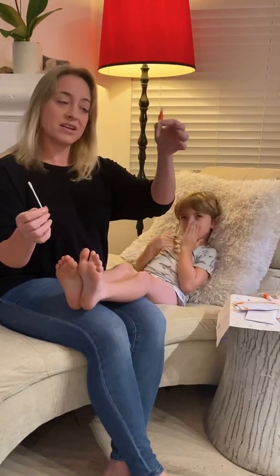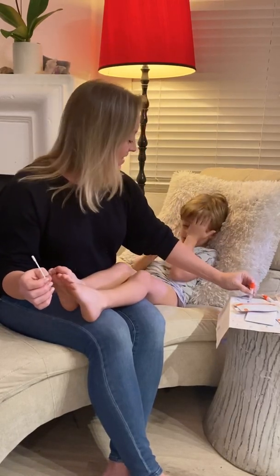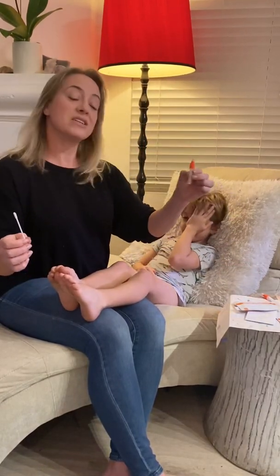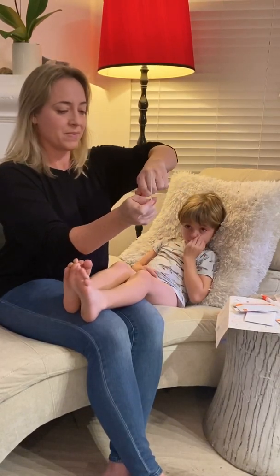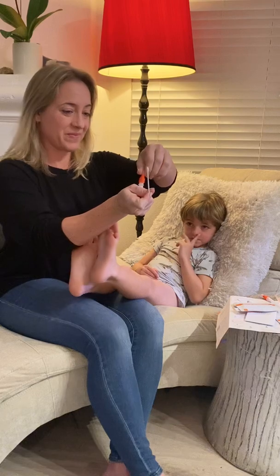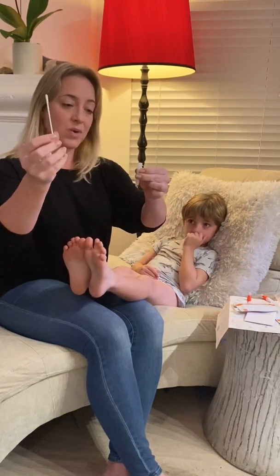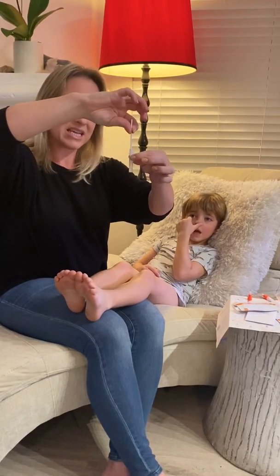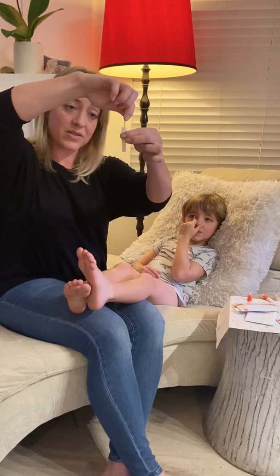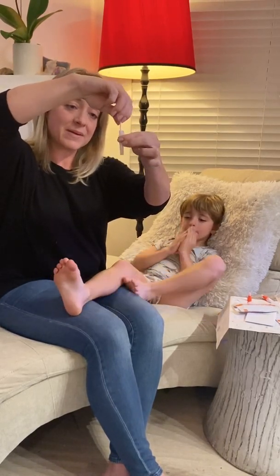Now we take our tube and tap it twice, then we open it. You don't need to shake it. Take the swab with sample and insert it directly in — try not to hit the sides too much because you want the sample to go all the way to the bottom — and turn it 15 times.